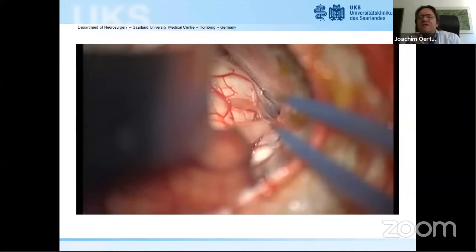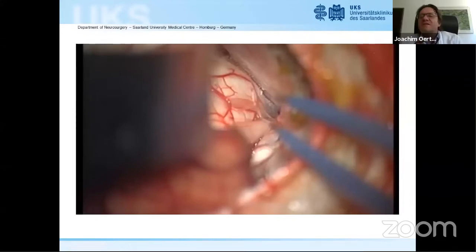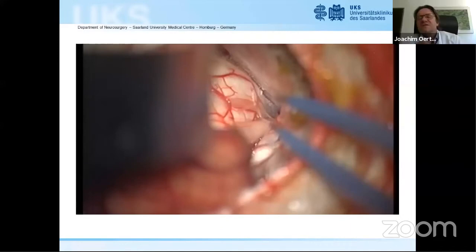You cannot bring them deep in the surgical field. It doesn't look like it, but the surface of the brainstem is six to seven centimeters from the dura. It's quite deep, and it's very difficult to bring the ultrasound down. So in my experience, the ultrasound is a good option for an intrinsic lesion where you can have the head of the ultrasound right at the dura. But here it's not helpful, too much air.